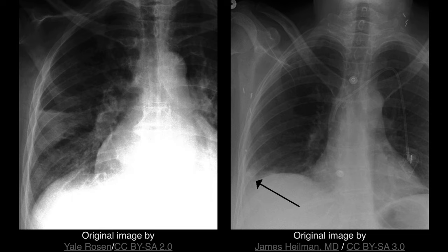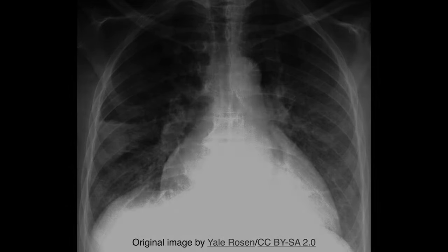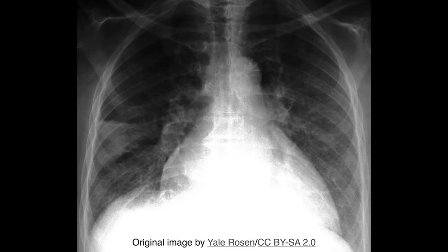The plain radiograph of a patient with a pulmonary infarction can be deceivingly normal, without any striking abnormality identifiable. In this x-ray, we can see a sign known as Hampton's Hump — a wedge-shaped opacity in the periphery of the lung, which is a rare but suggestive finding of pulmonary infarction. The base is juxtaposed to the pleural surface, while the rounded apex (the hump) is angled towards the hilum.